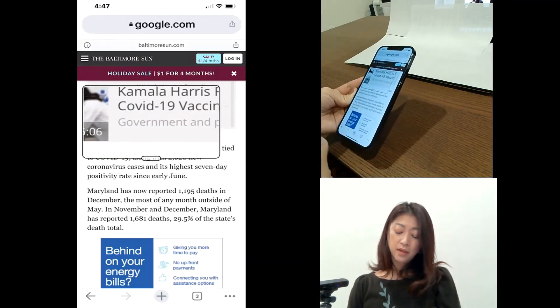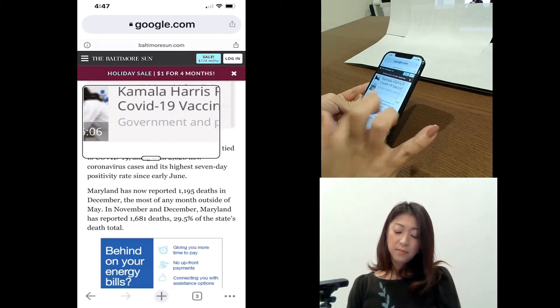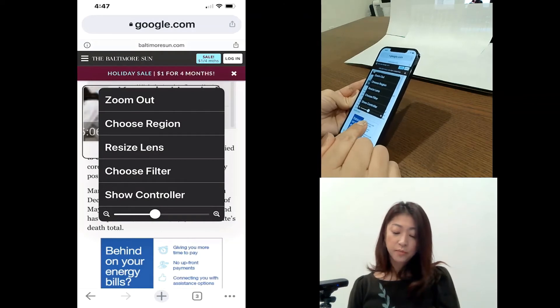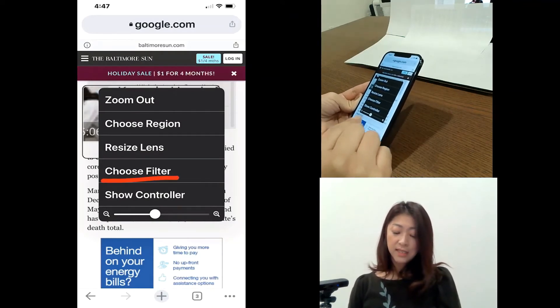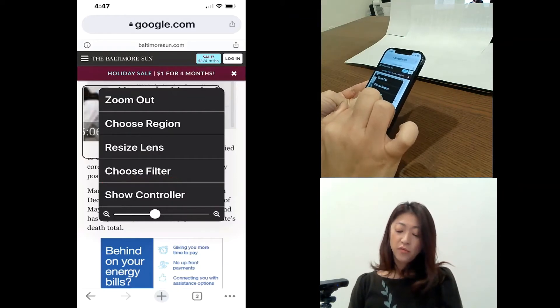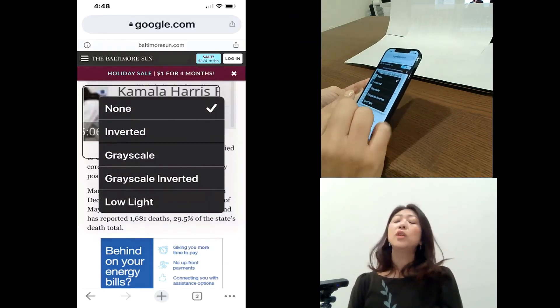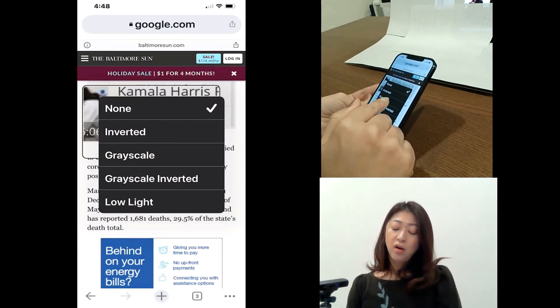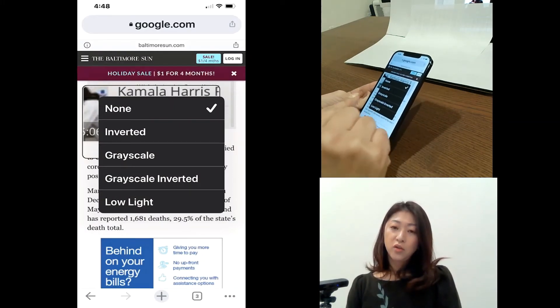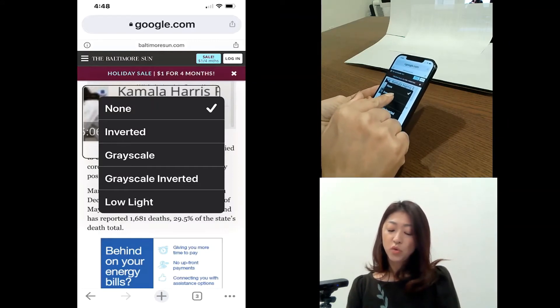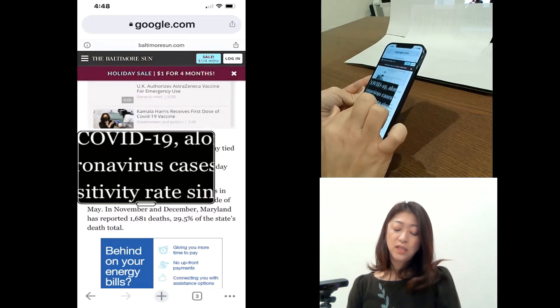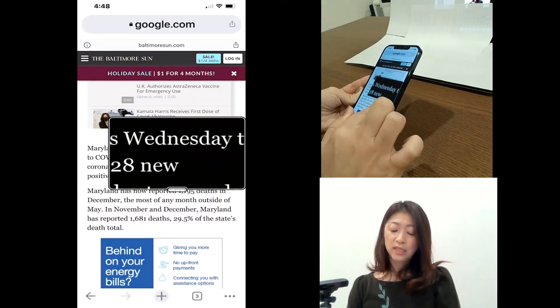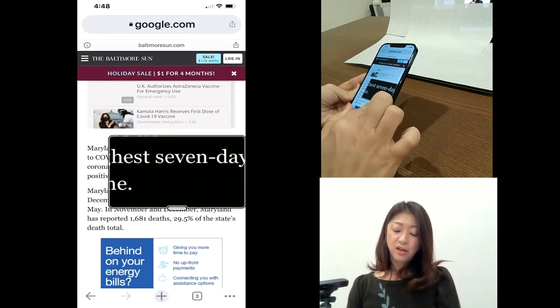Okay. And then tap the handle to get to the menu. And then below the resize lens, it says choose filter. So from here, you can choose the color filter of the zoom window. So if I choose inverted, like you can see what's shown inside that window, it's inverted color.